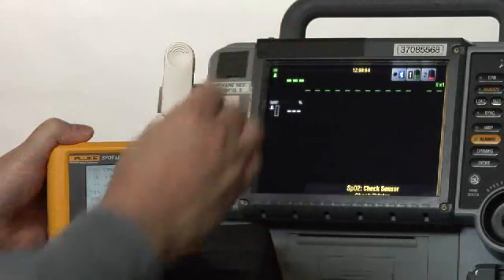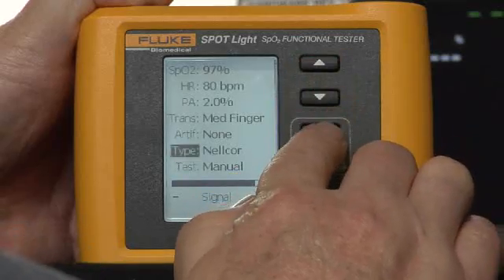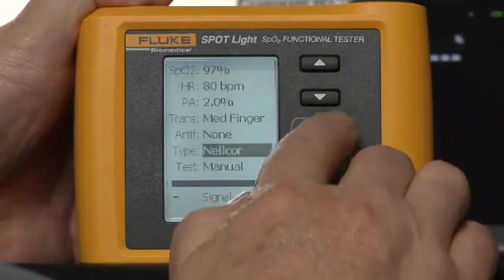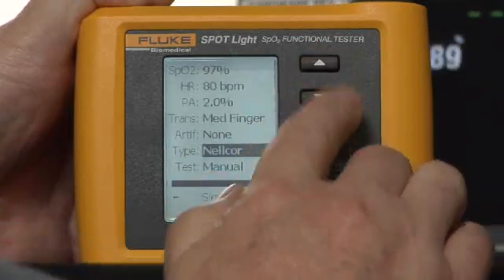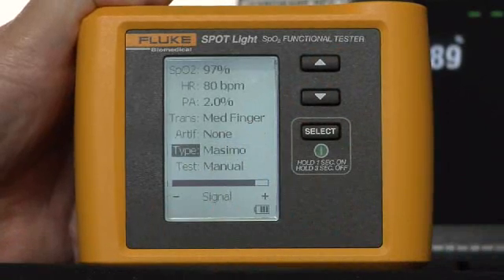And the only thing I need to do is arrow up and change the type to Masimo.